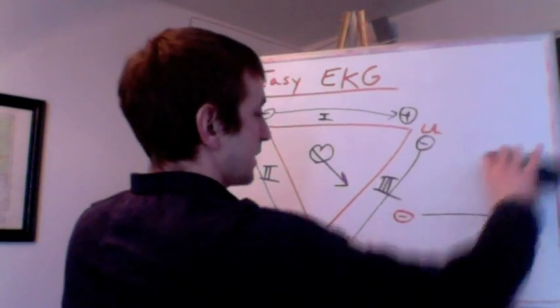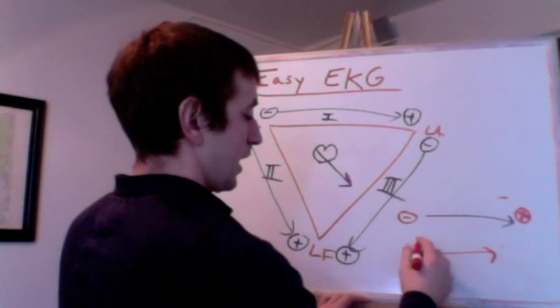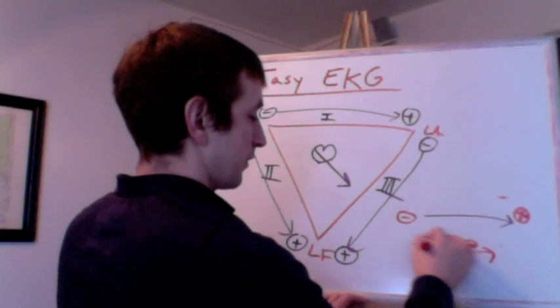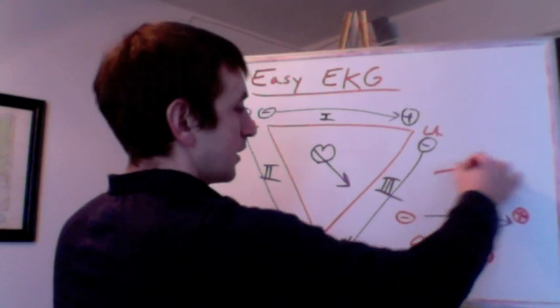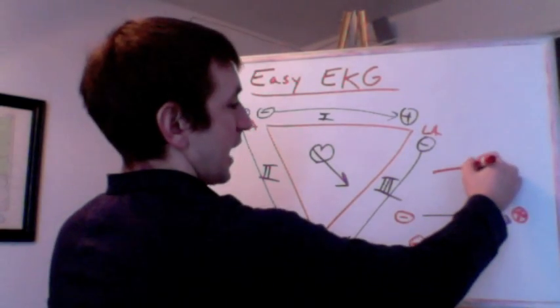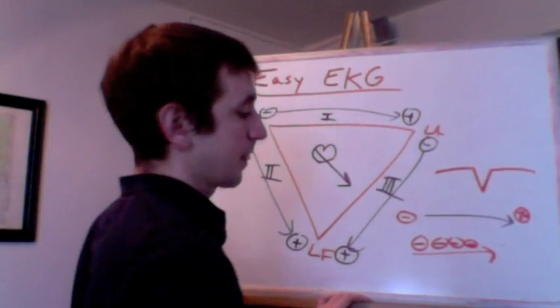So, the same thing can be applied to the positive side. If we have negative friends coming over to hang out with the positive guy over here, the positive guy doesn't really like to have negatives around him, so he's not going to be happy, he's going to be sad, so you get this negative spike, right?